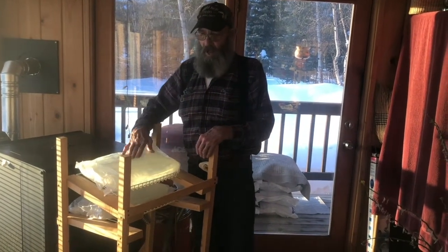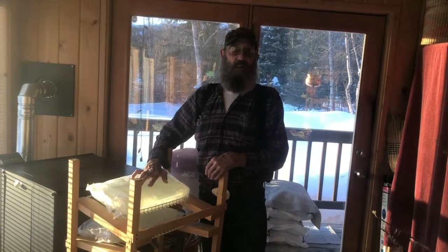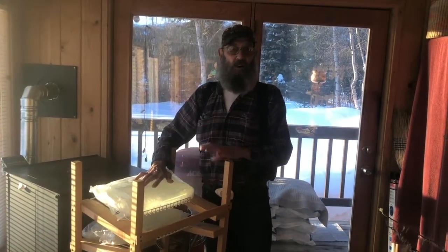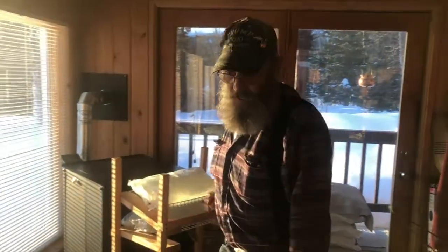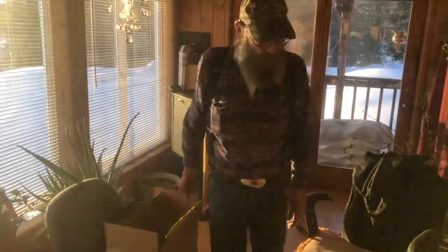This is the cheapest way to heat your fluid up so it's not cold. That machine that we have, Alice, she really warms that stuff up. We start this at around 7 o'clock, so by the time I'm ready to hook up, finally at 10 o'clock, the water is warm, everything's perfect. It works really well. And this is where we heat the fluid. And these are the boxes that it comes in. Pete will bring this upstairs when we head up there and get ready to do this.